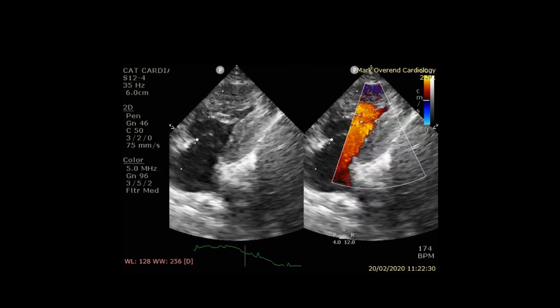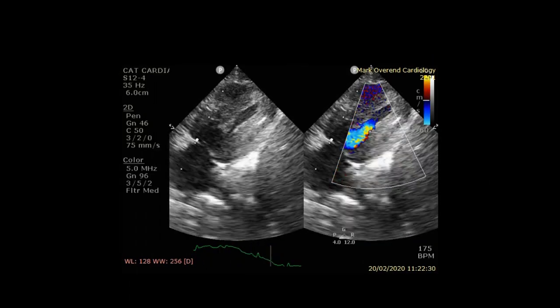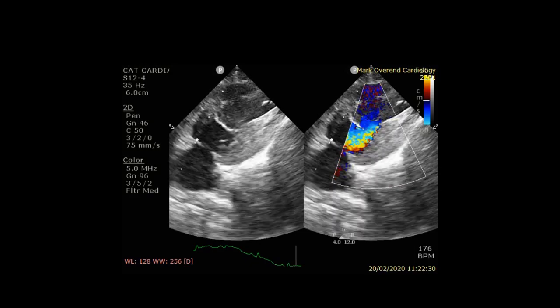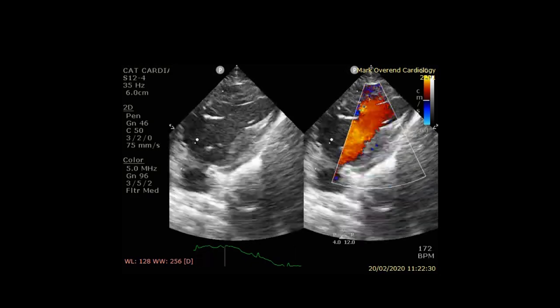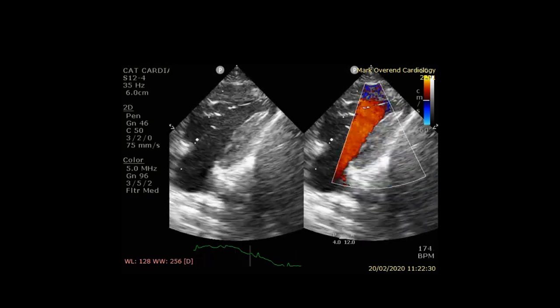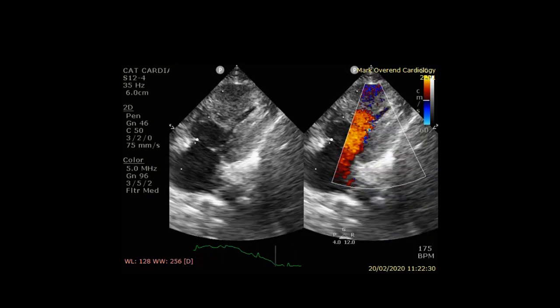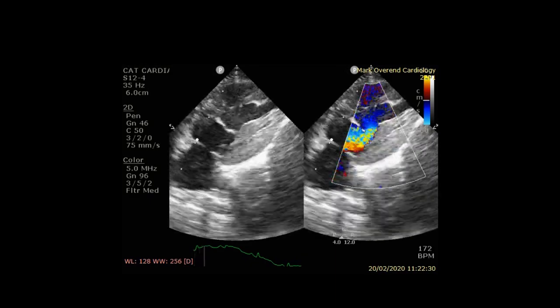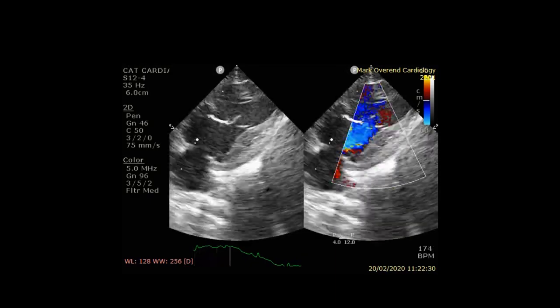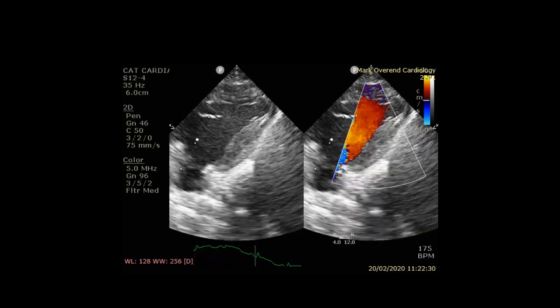With colour flow Doppler added, you can see blood accelerating through the mid portion of the left ventricle as the left ventricular outflow tract becomes dynamically obstructed through systole.